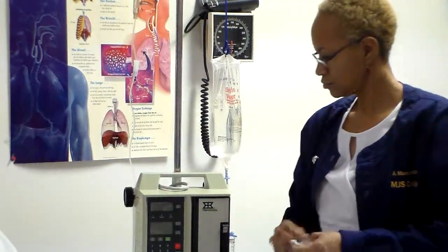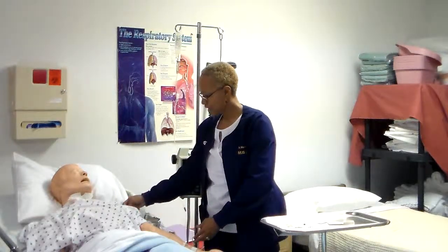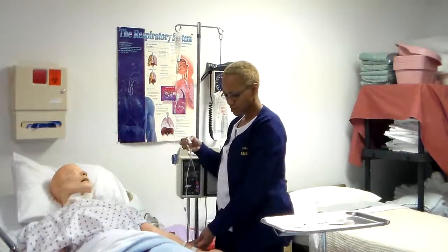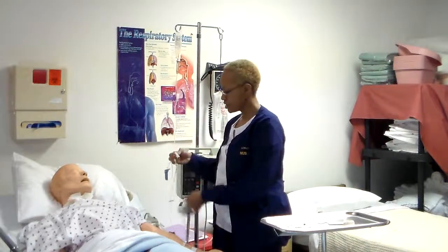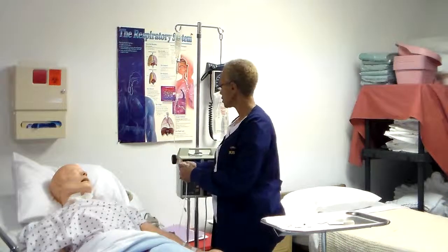Connect tubing of piggyback or tandem infusion to appropriate connector on primary infusion line. Now always think about how irritating that medication is. The more irritating it is, you want to back it up a little bit away from the site. So I'm not going to use the port that's closest to my client. I'm going to go back just a little bit. I'm going to give the port a good scrub.